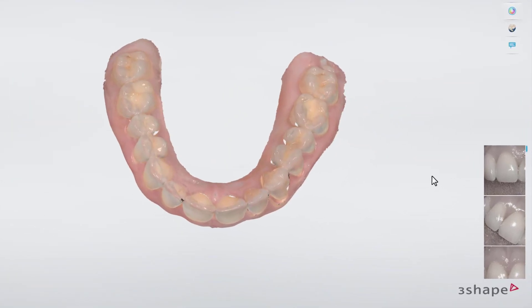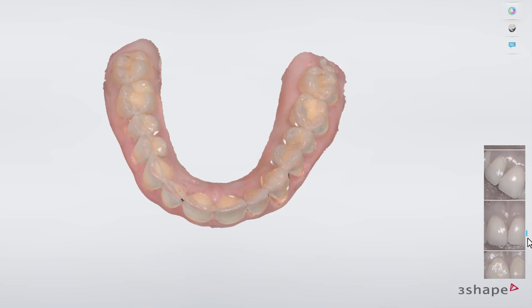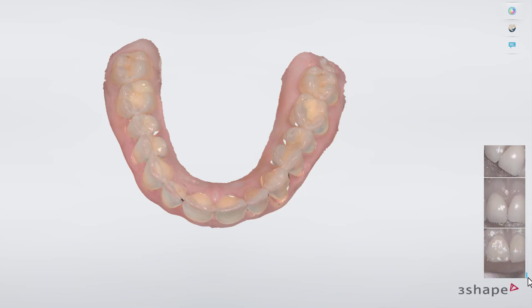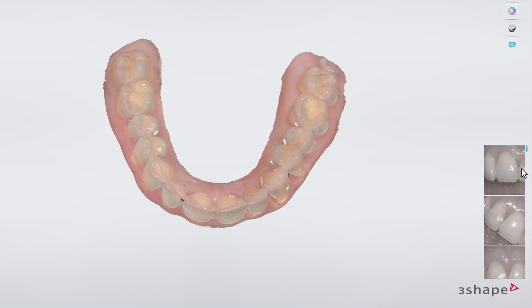A scrolling thumbnail menu of the added HD Photos appears in the right lower part of the screen. It shows the corresponding scan in the main window when one of the pictures is selected.